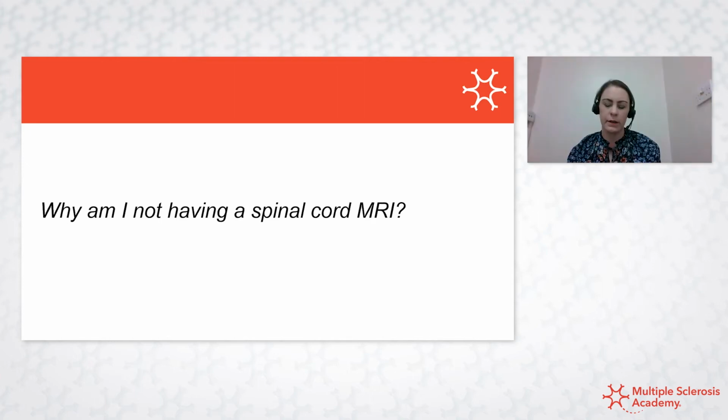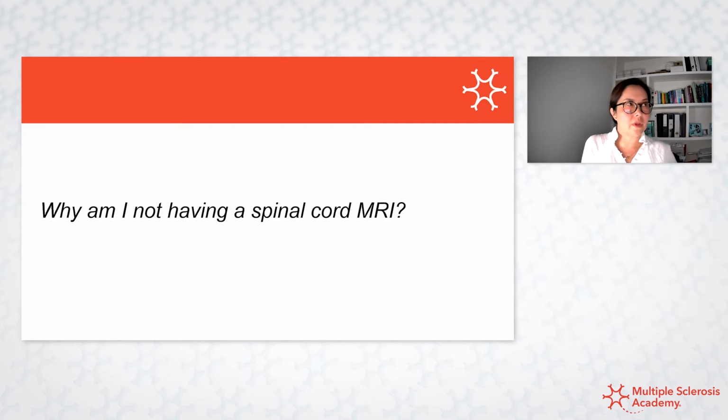Do you guys do a spinal cord? I think it's similar. I don't know. No, I don't think it is routine. As routine as that. No. So it's interesting. There's this variation across the country. Yeah, and that's because there isn't comprehensive data justifying whether or not you should do a cord MRI all the time.